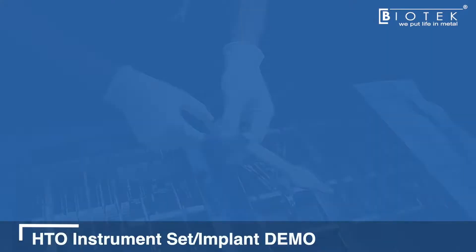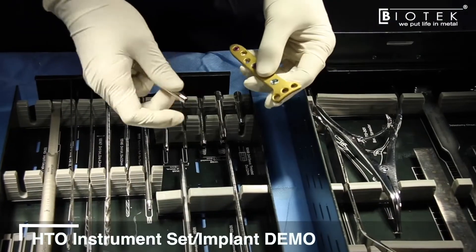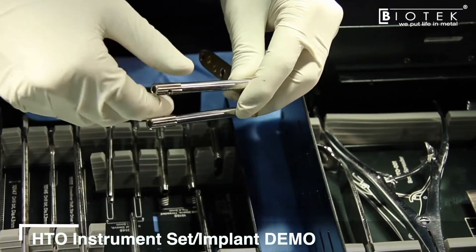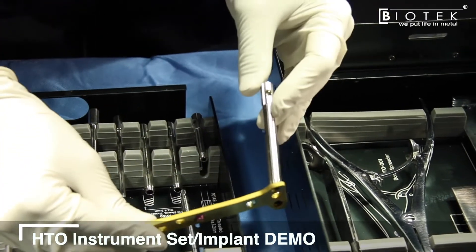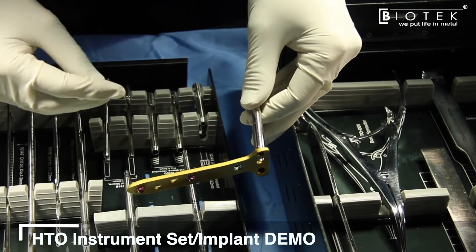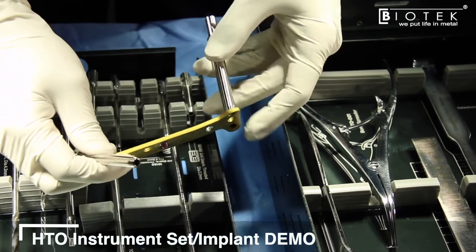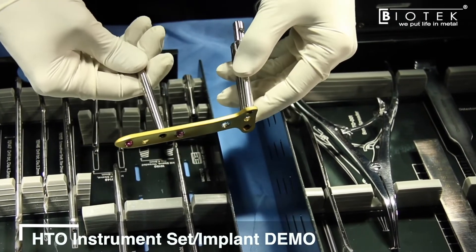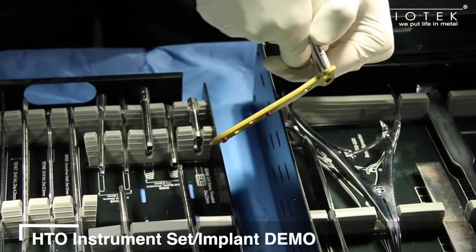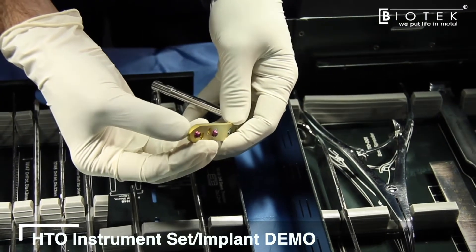Once the osteotomy is performed and the desired opening is achieved, the Biofix implant is used. It comes with four locking sleeves angled at 15 degrees inferiorly, greatly reducing the risk of perforating the articular surface if the plate height is adjusted properly. Two sleeves can be placed in two holes and used as a driver to slide the plate into the incision site. The beveled profile of the plate allows it to glide in freely just superficial to the periosteum.